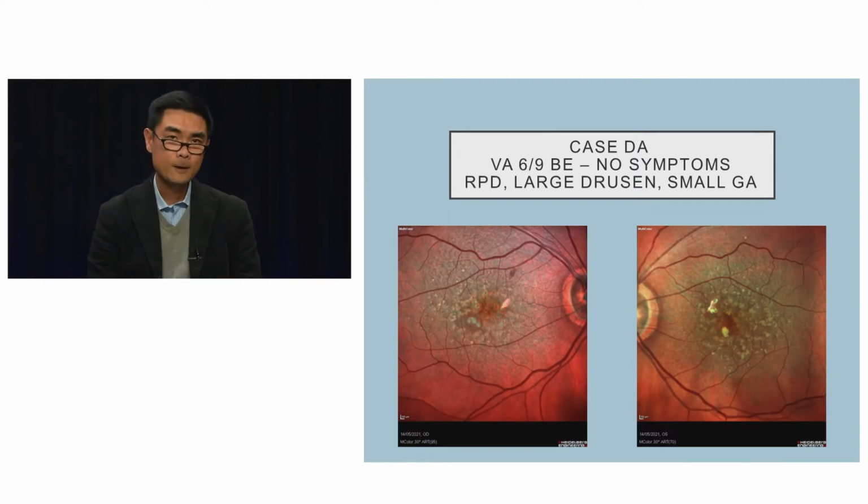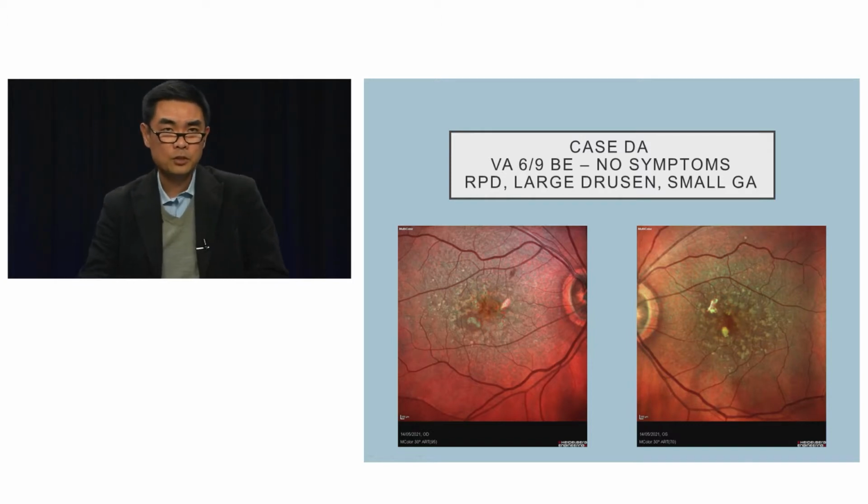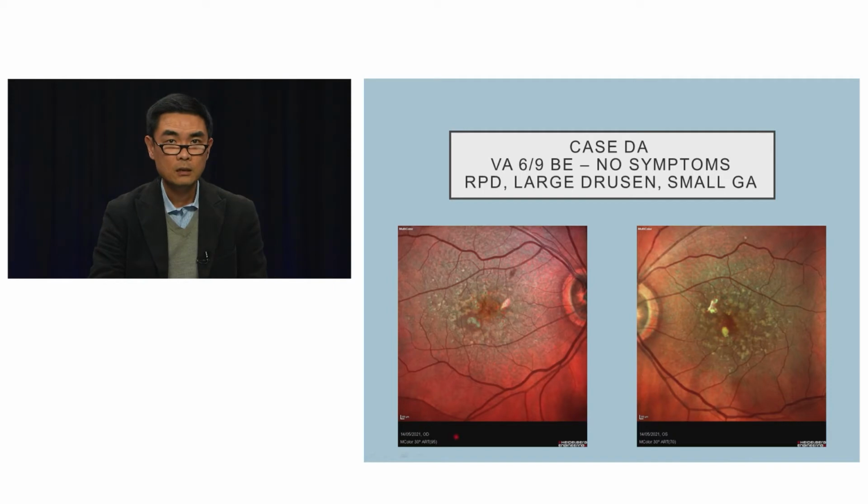The first patient is a patient with dry macular degeneration. You can see large drusen. I've got my pointer here, so you see large drusen. Patient also has patches of geographic atrophy there and there. Interestingly, this patient also has reticular pseudodrusen. So you can see a network or reticular pattern of subretinal lesions in the supratemporal, but also the inferior macula on both sides.